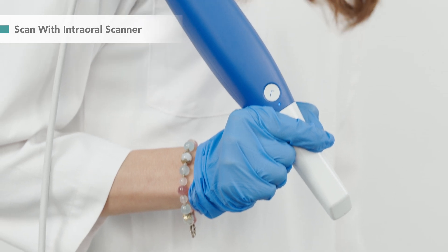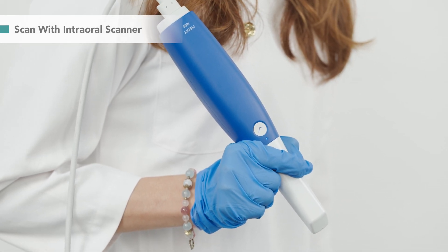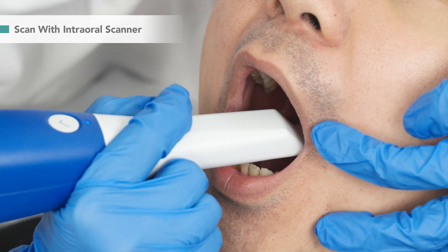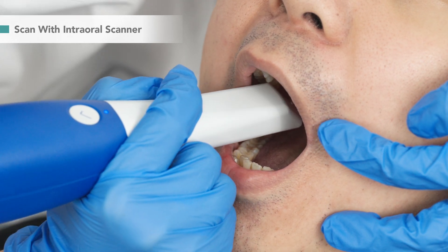We start by creating the digital impression of the patient's teeth. With any intraoral scanner, you can quickly scan each tooth and accurately convert them into scanned data.